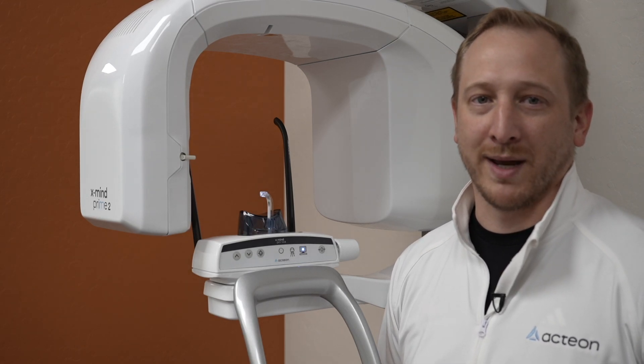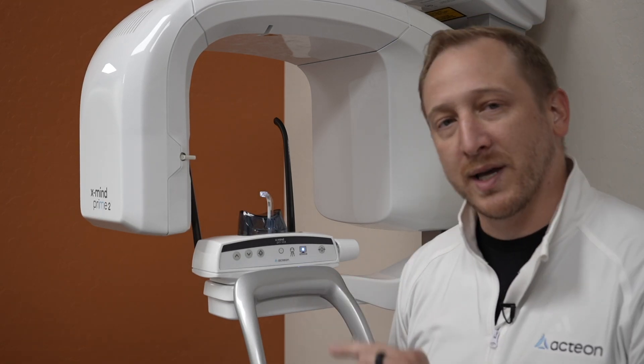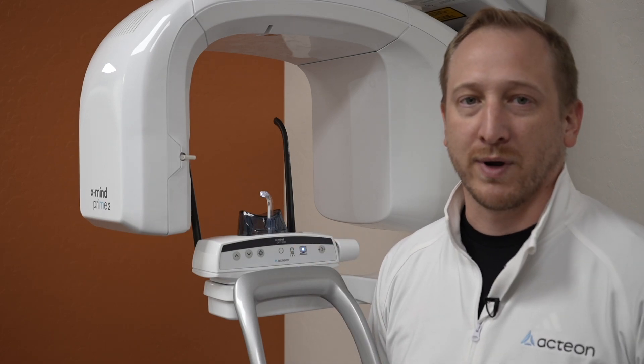Welcome to the walk-around of the X-Mind Prime. We're going to showcase what the buttons do and what we're going to use the different rests for.